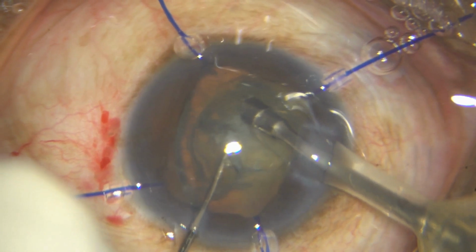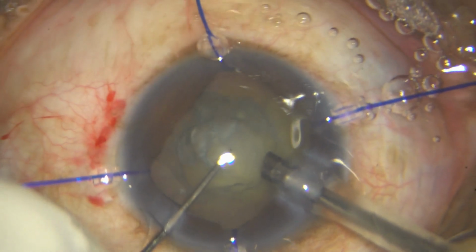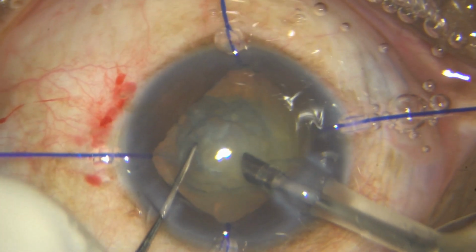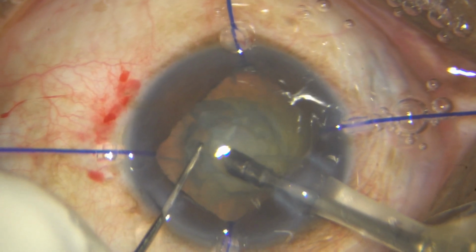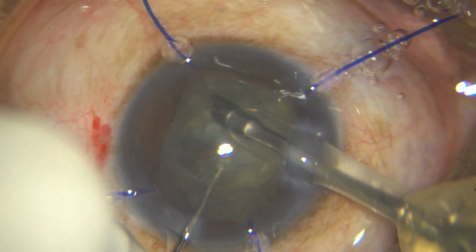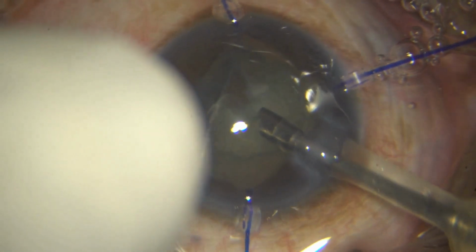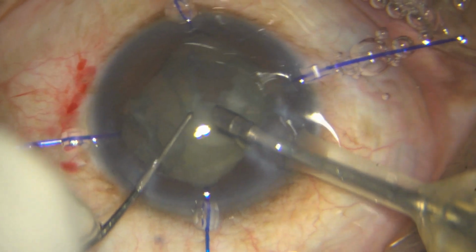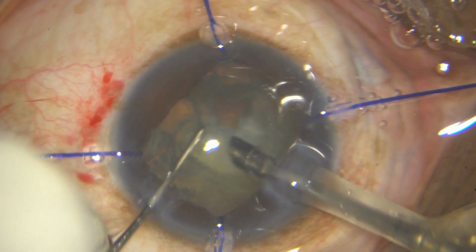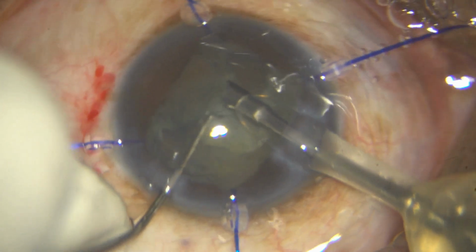And that's what happened. I realized that in the first chop. So I go a little behind. I'm finding it difficult to rotate it also. I do get a hold and manage to get a chop. Once you get that chop, unfortunately this piece has come out, but anyway, once you get the chop, I find it much easier to rotate. And you can see there's just that small bit of central core nucleus with enough rigidity to give you a hold. The rest is just epinucleus. So I'm very carefully chopping my way through.